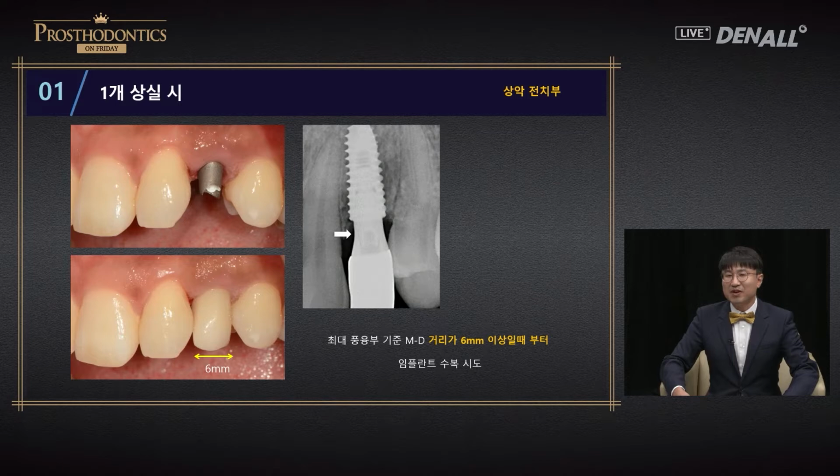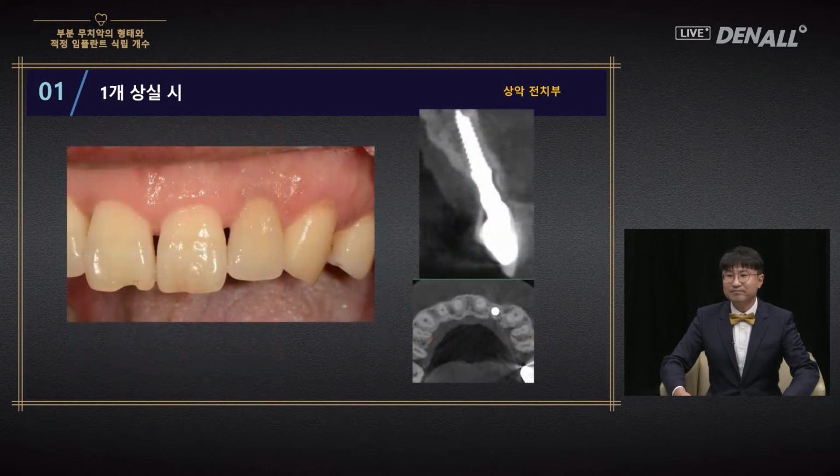As you can see, you cannot make the abutment thinner than this. Even if you make it like this, it is very difficult to place an implant in a 6 mm space. If the mesiodistal distance of height of contour is not 6 mm, you can place a one body fixture, but this is not an easy choice.